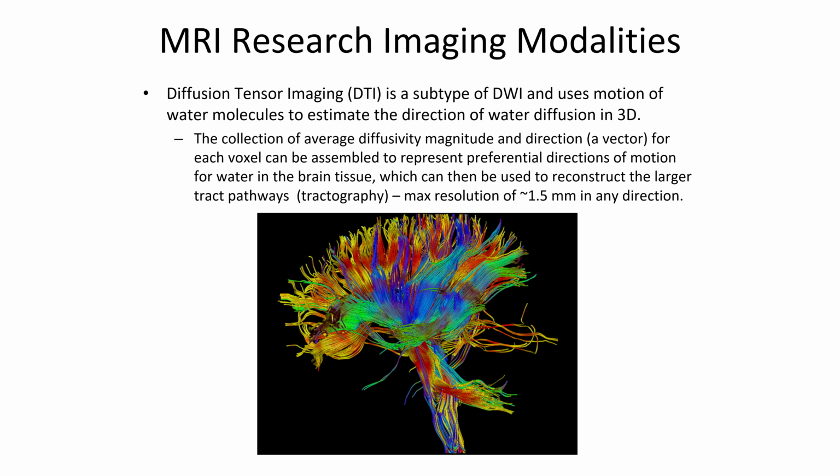Now, there are also a lot of cool research projects going on in MRI. They're always trying to find new imaging modalities, like how do you image Alzheimer's? How do you look at time of flight or proton density or all these cool things. They can even use really strong magnets, like up to 18 Tesla, to look at protein structures. Remember, the strength of the magnetic field B0 is directly proportional to not only the signal strength, but also the slice thinness that lets you get high resolution. So all sorts of cool things.